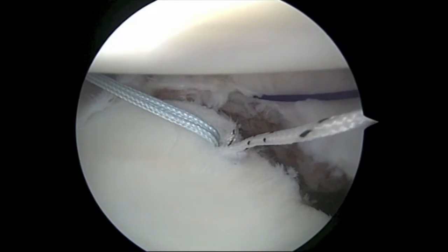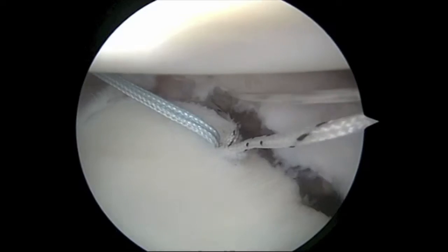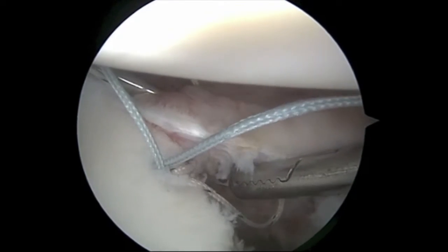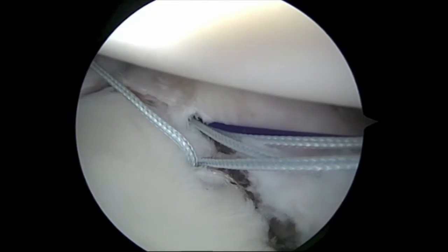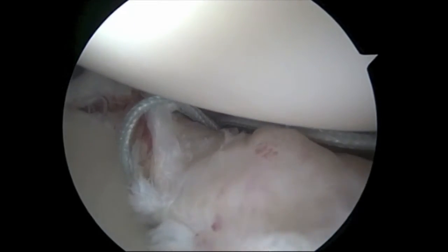We now have an anchor down in the bone. Attached to it is the white stripe suture and the pale blue suture. And you can see that we're using a little instrument to pass a purple suture through, which helps us pass the other suture back through the labrum. Now both sutures are in and we can start to tie.